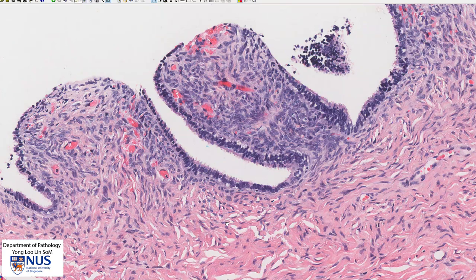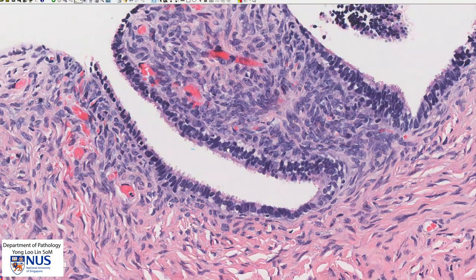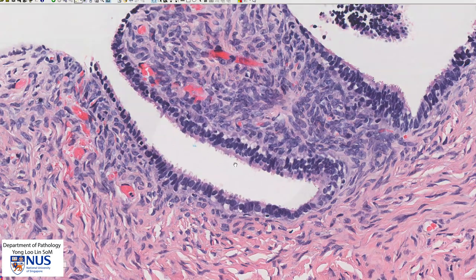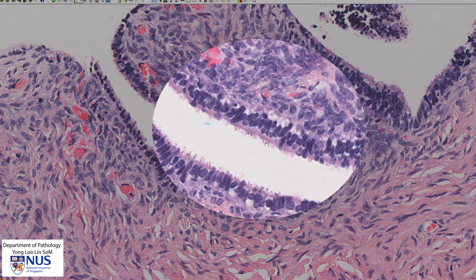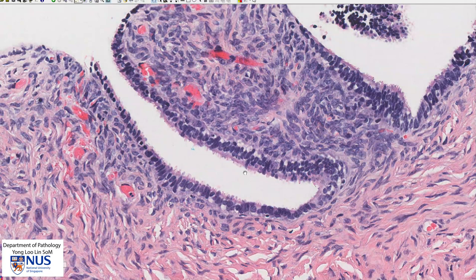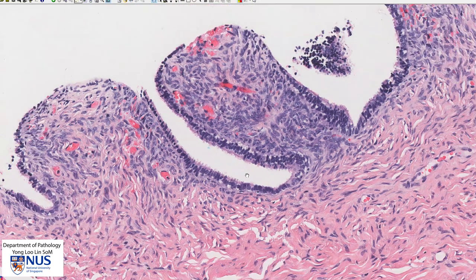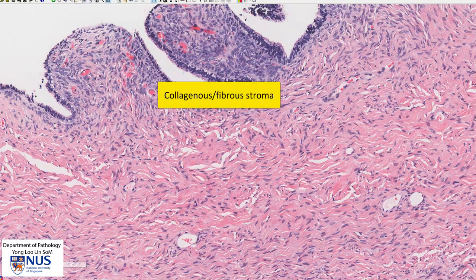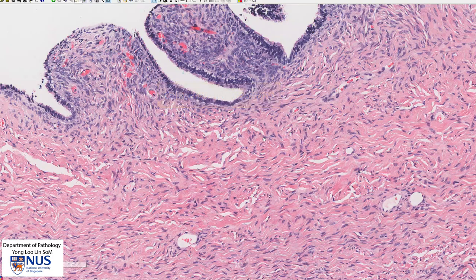Let's look at another area and again you can see these columnar cells with cilia on the surface. The epithelium is known as ciliated columnar epithelium or tubal type epithelium. Below this we have quite a dense collagenous stroma — you can see these pink strands of collagen — and again this is classical for a serous cyst adenoma.